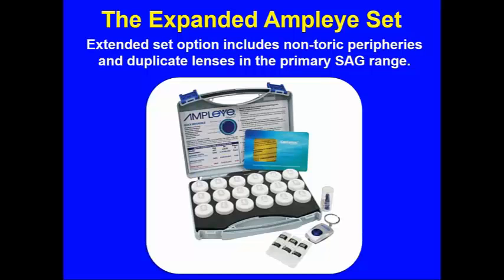Now there is an expanded Ampleye set. This was predicated on the fact that we found that in fitting many of our patients, they required a similar sag depth lens on both the right and left eyes. So the extended Ampleye set incorporates additional lenses to allow one to place the same sagittal depth lens on both the right and left eyes.